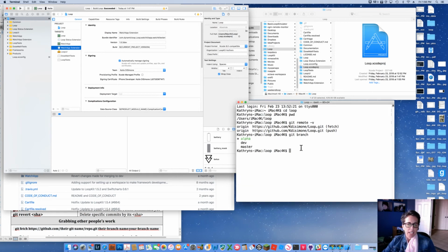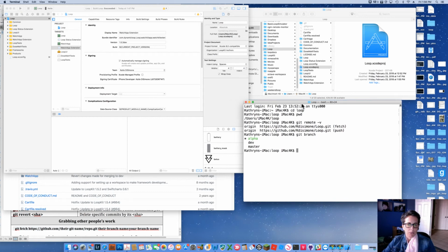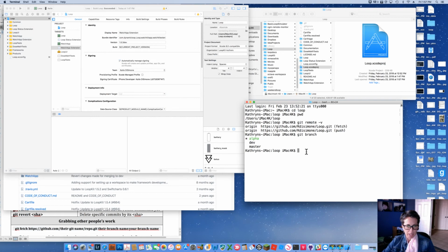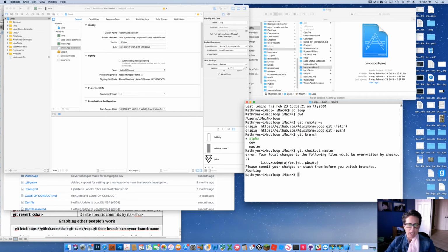And so if you try and exit out of a branch and go to a different branch before you've told it whether or not you want to save those changes, those modifications that have the M, basically my modification is that I changed this from loopkit to dynamic loop, my bundle ID. If I try and leave this and go back to, let's say, the master branch, git checkout master, I'm going to get an error message. The error message tells me I have changes in here that I haven't told the program what to do with. It's saying, do you want to keep them? If you want to keep them, you have to commit them. If you don't want to keep them, you have to stash them.